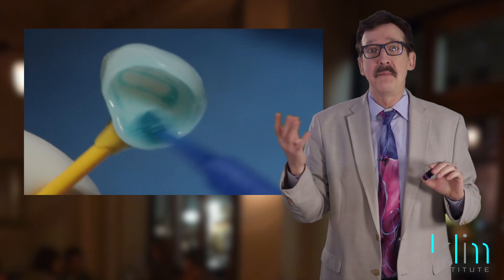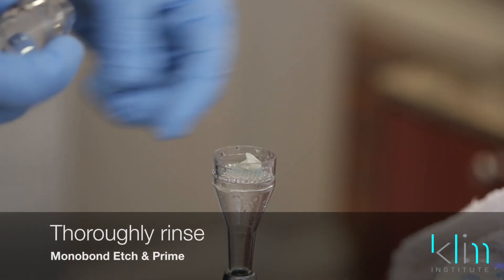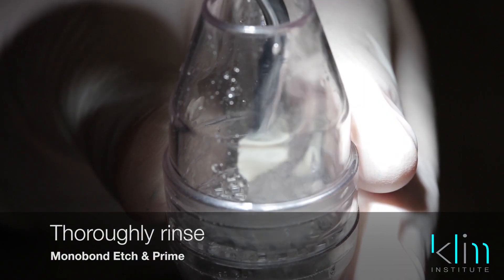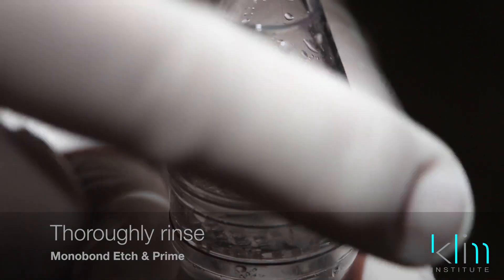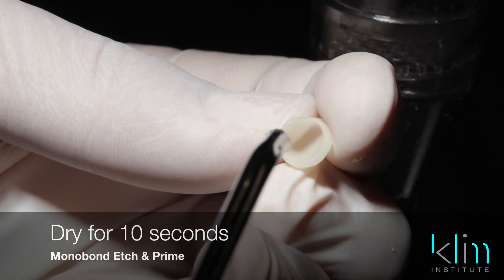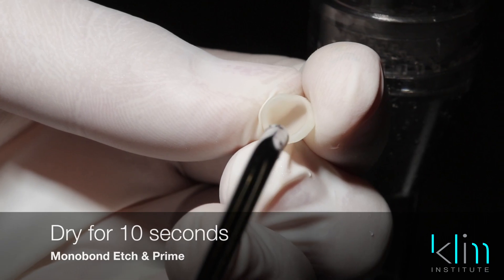Let's suppose you're talking to the patient and it goes for three minutes — you're going to be fine. All you do is rinse it off. This is really important: after you rinse and make sure all the color is gone, you're going to dry for 10 seconds — you'll need to count that out.